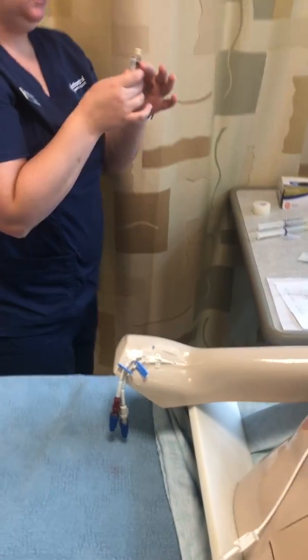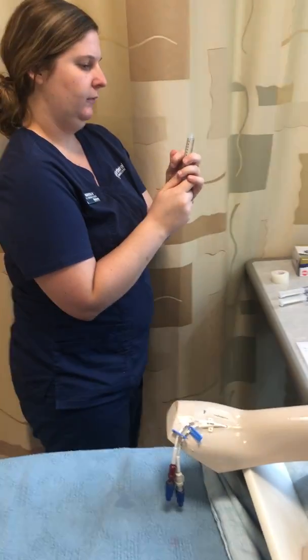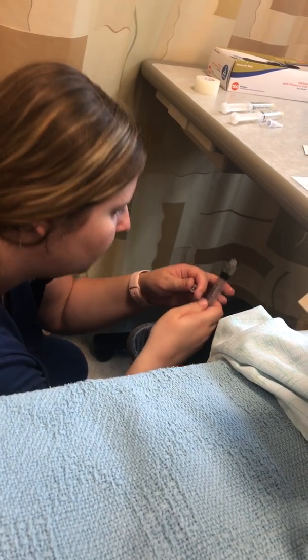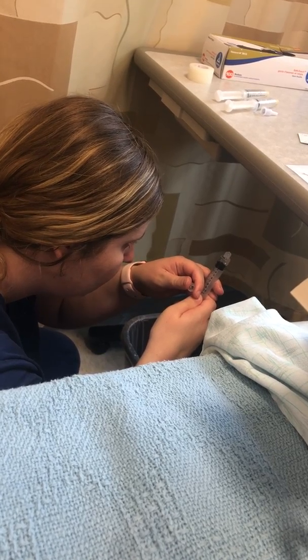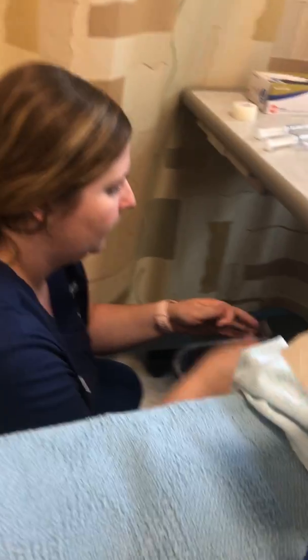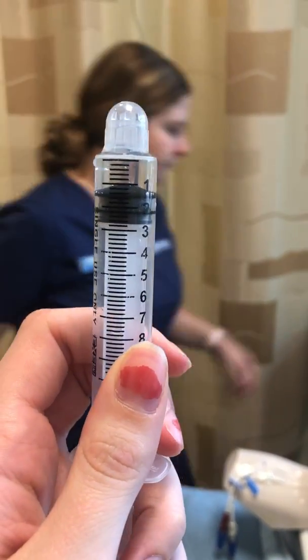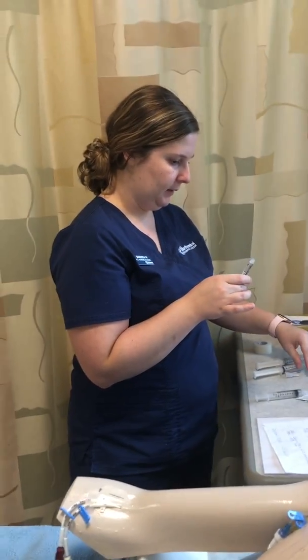This one has a big air bubble in it, so I'm actually just going to grab a new flush here right away. And I'm going to get this down to 1.5. So that's 2, 4. So I need it right between 1, 2, 3. There we go. So this is 1.5 of saline solution.